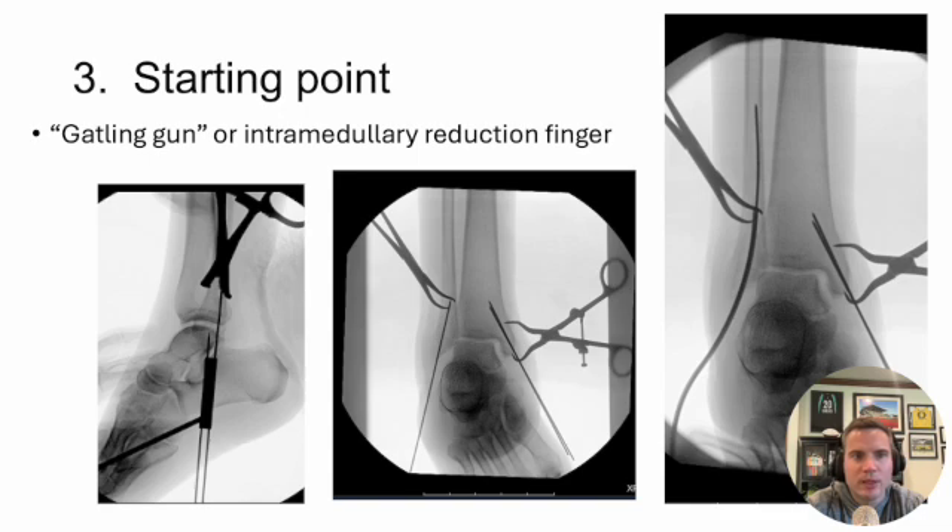Tip number three is getting your starting point right — I also thought about calling this 'use your tools.' If you stay too far lateral, you'll ream out the lateral wall. If you stay too far medial, you won't have good fixation. There are tools to help: the Gatling gun gives you a couple millimeters of offset to place another guide wire. Another option is the intramedullary reduction finger — sometimes the K wire wants to hit the medial cortex of the fibula, so you open it distally, introduce the intramedullary finger, and advance the K wire up into the canal. You have to make sure your start point is correct.